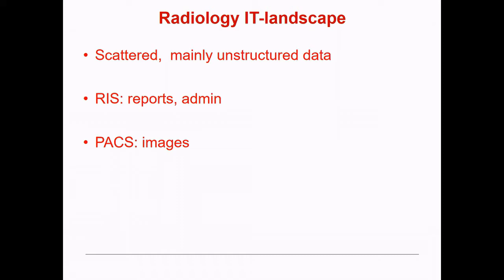And then it's lacking. So whereas you on the one hand see, especially in clinical trials, measurements or complex measurements that are used in these studies to maybe predict something, then if you look at medical data, it's at best in an unstructured form in this piece of text. So that's why I would say it's scattered and unstructured.